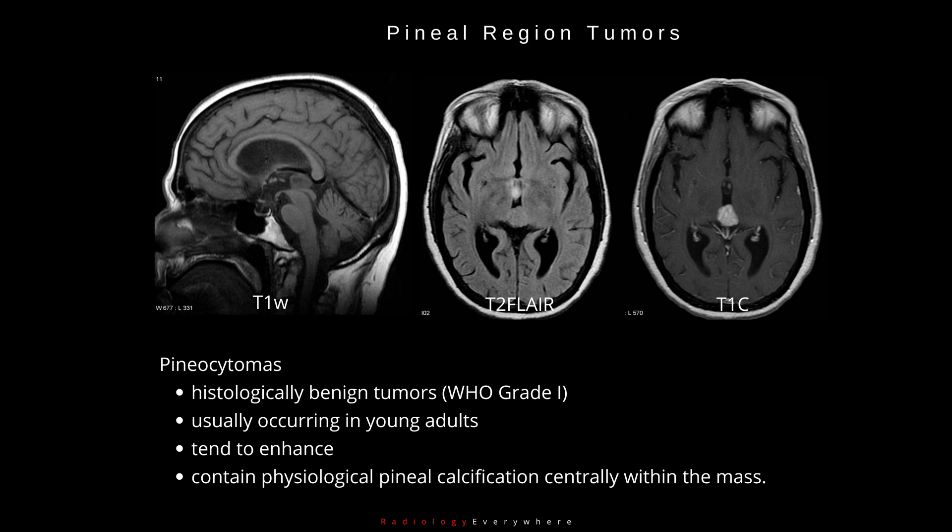Pineocytomas are largely histologically benign tumours, WHO grade I, usually occurring in young adults. They lack specific imaging features, although they tend to enhance and, by contrast with germinomas, contain physiological pineal calcification centrally within the mass.